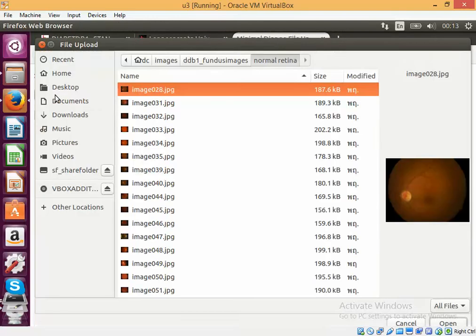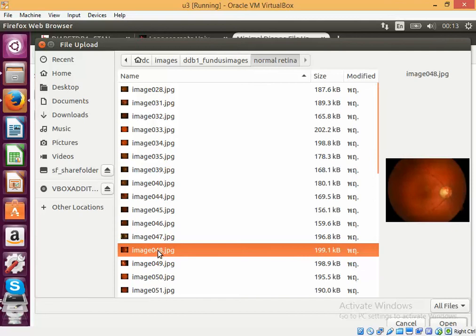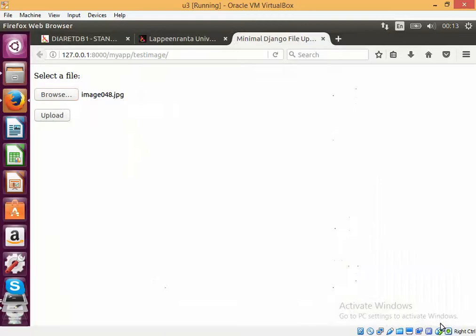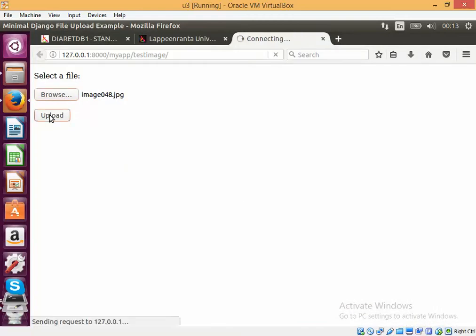Okay, let me browse a normal retina for example and let's see whether it can predict it properly. So this is in the folder normal retina. Let's open it and try to upload it.